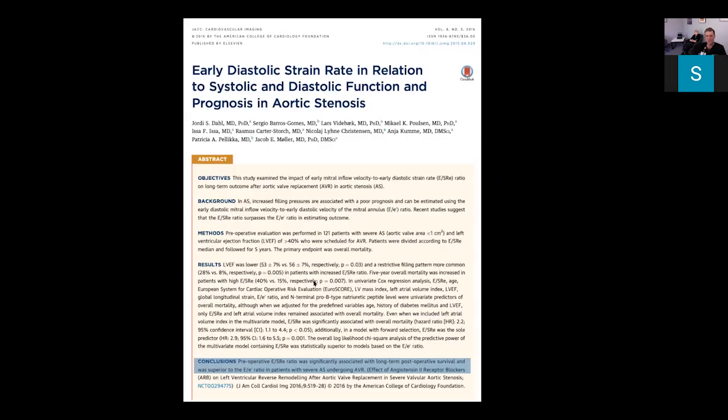And this has been used in a handful of studies. I think I've only seen one or two where the diastolic one, SRE, has been used by one of my heroes, Landesberg. She's an amazing intensivist. But anyway, they've looked at this E over SRE ratio, maybe say it's important. Again, very, very research-based, but there are a handful of studies that have gone out to look at this.